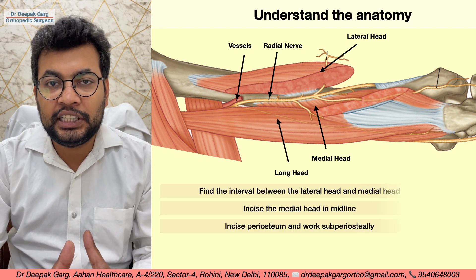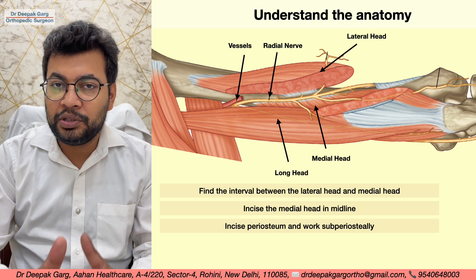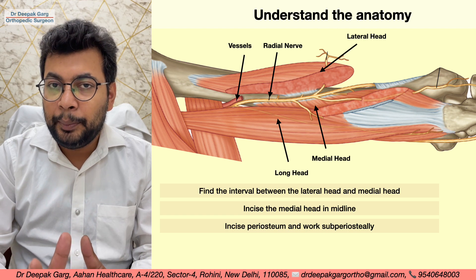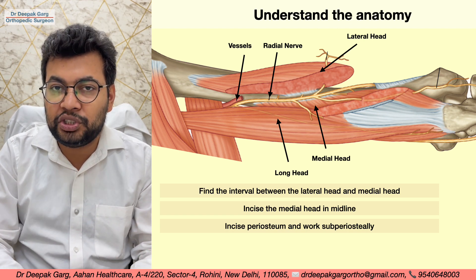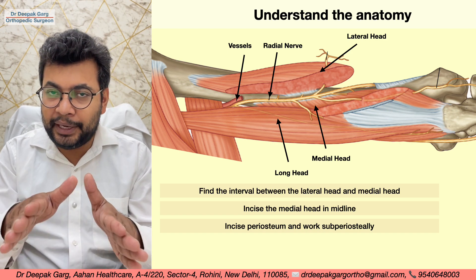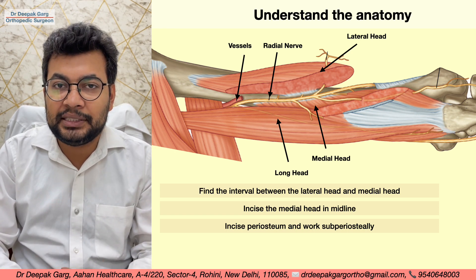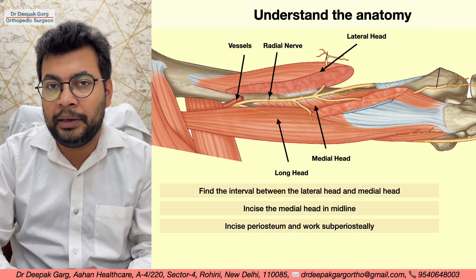Once we identify the vessel and the nerve, we retract them. We then take a midline incision through the medial head of the triceps. This exposes the periosteum, which we incise and then separate the muscle subperiosteally. This gives us the working space where the bone is exposed and we can fix the fracture and apply the plate.